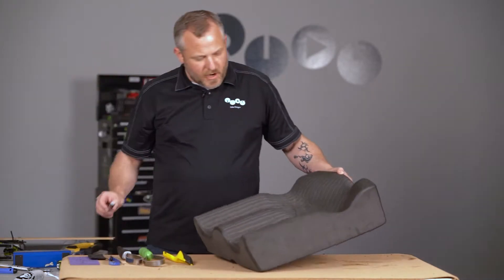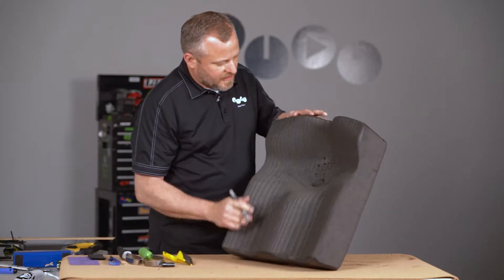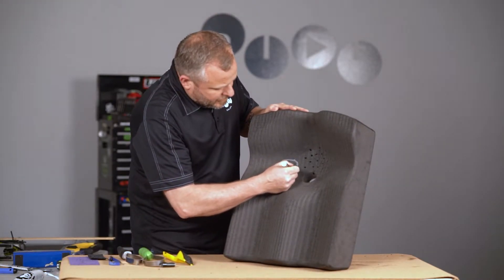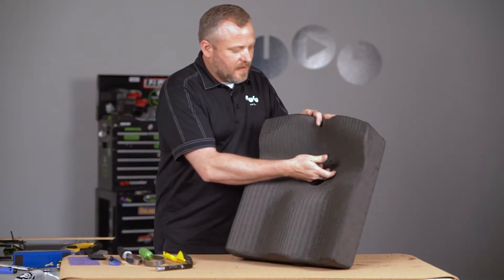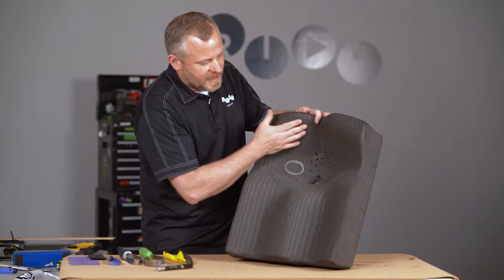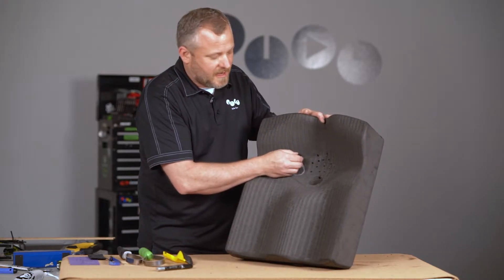I'm going to take a little marker here. You've palpated and determined where that IT is — let's say it's right here. We don't want to go too big. Under the areas that are not weight-bearing surfaces — the ITs, the trochanters, the coccyx sacrum — those areas we can be pretty aggressive with how far we cut down.